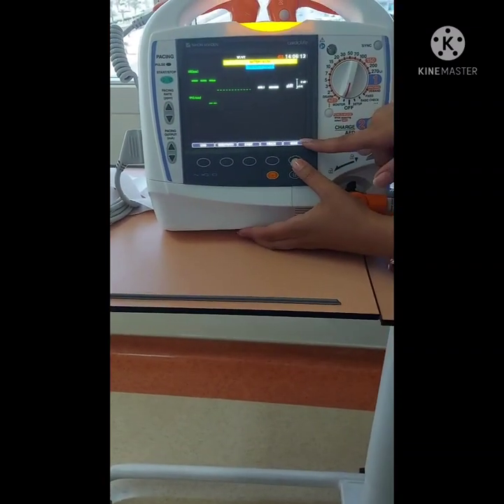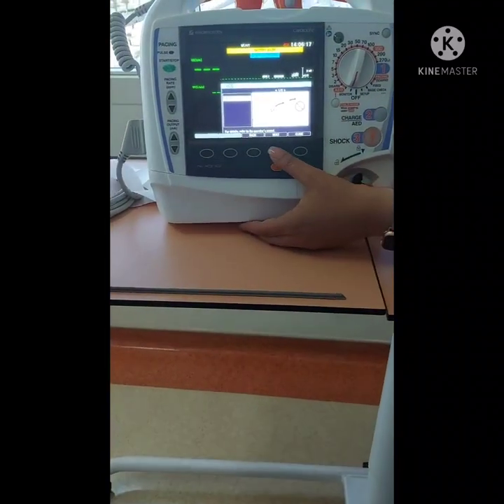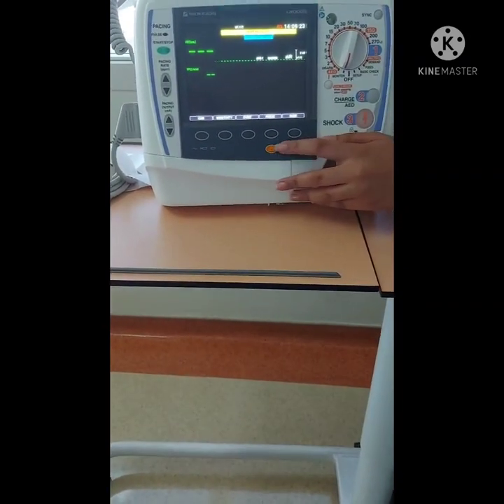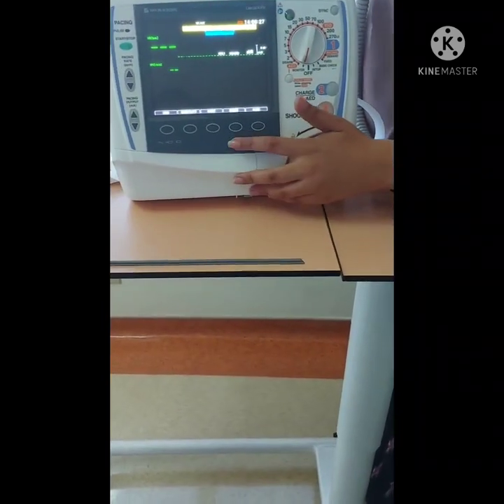And here we have a guide. It's gonna tell you exactly what to do and how to do it. Next, what are these and how can you connect the ECG. Close. Here, this is for the alarm silence. If you want to silence the alarm, you just have to press this one.